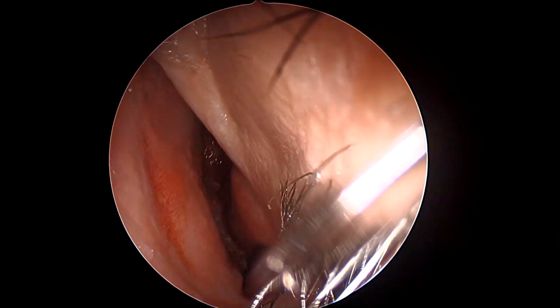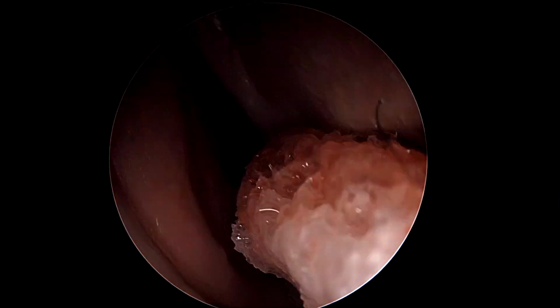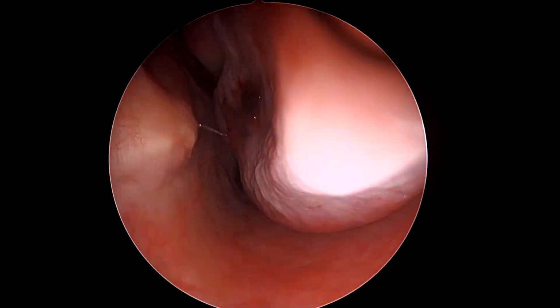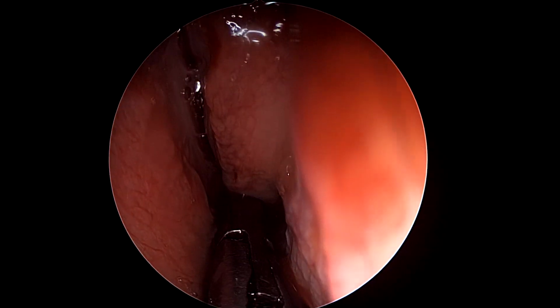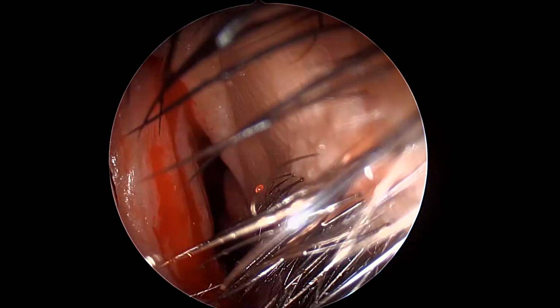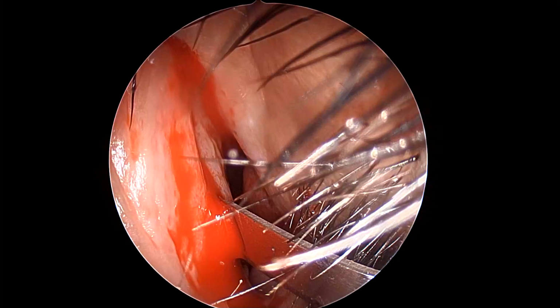And now that that access is somewhat done, we initiate the surgery on the left side. And like I said, on the left side we will not go ethmoidal. We will go septal. So we give a septoplasty incision, the Freer's incision, and we will elevate the septal flap, and we'll take down the posterior septal bone. But at all times, we will maintain the integrity of the septal flap so that it is usable in case we need it.